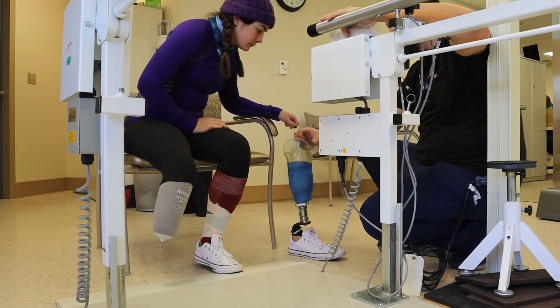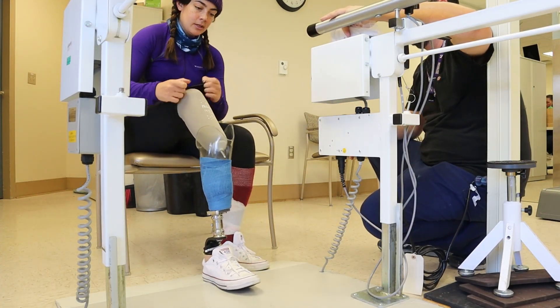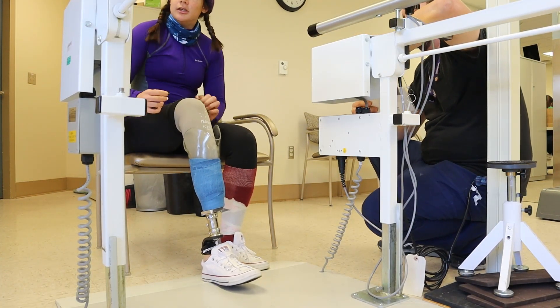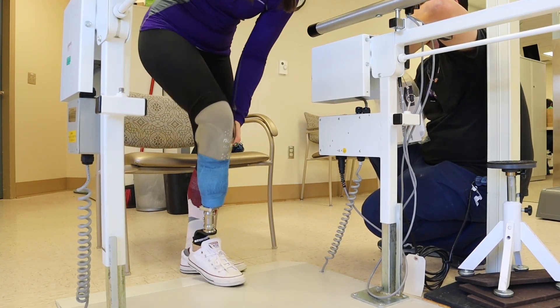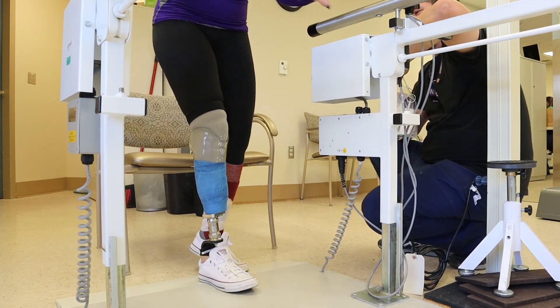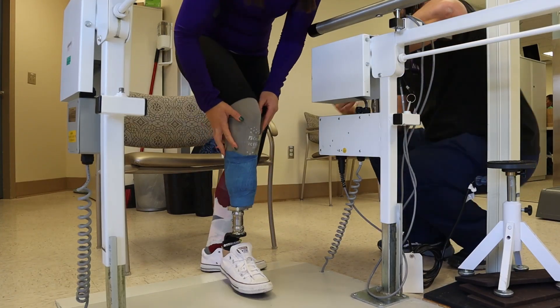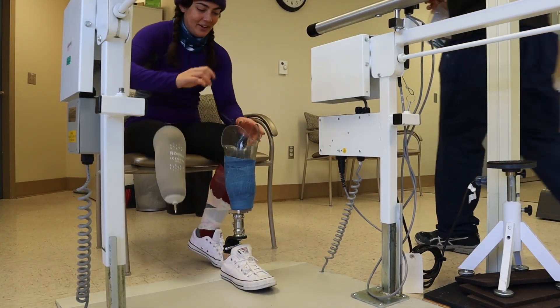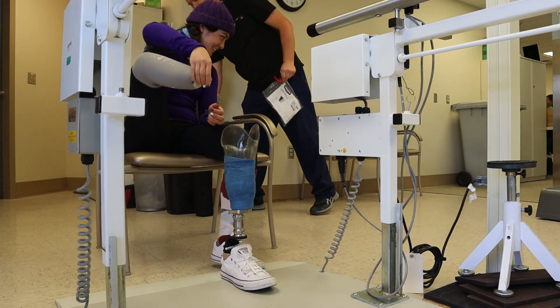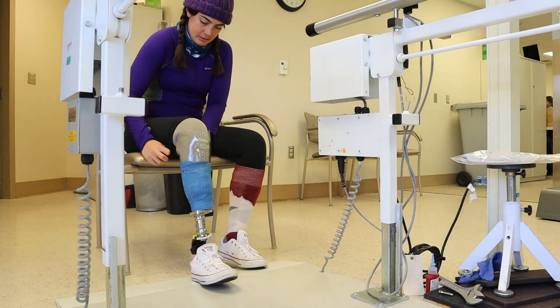I think we have you outside too far. We'll find out pretty fast though. I've got a three-ply and you should be able to stomp your way in now. Not issues. Feel it. You in? Maybe. I'm not hearing it. Oh, we're on the wrong pin. Wrong pin. I was like, this isn't working. The processor of course is going to try to regain the alignment because the socket was broken.